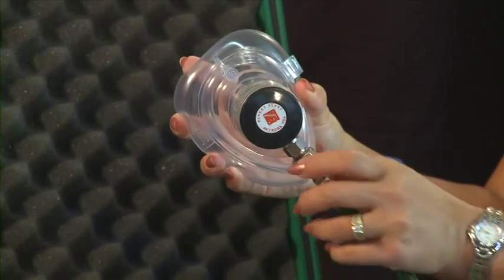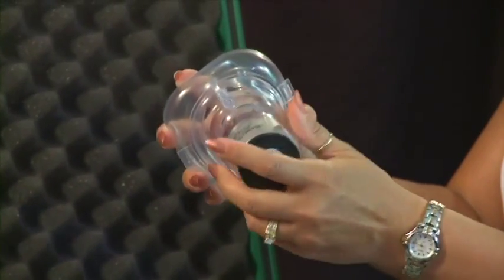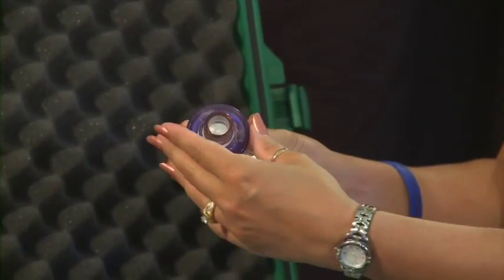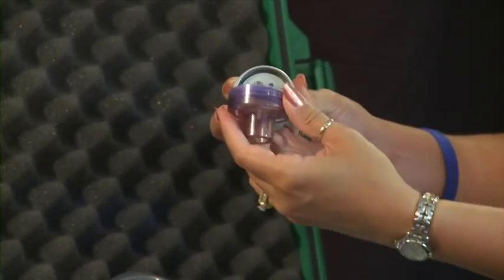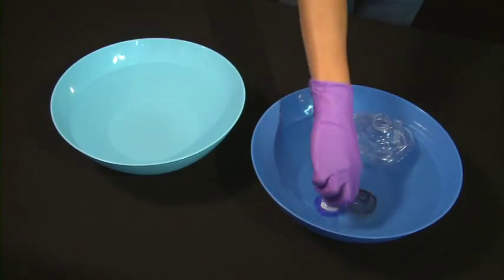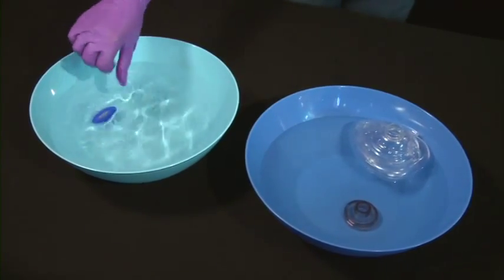Disconnect the demand valve from the green hose. Gently rock the mask back and forth to remove. Unscrew the plastic mask adapter from the demand inhalator valve and remove the exhalation valve assembly. You should clean and disinfect the plastic mask adapter, the exhalation valve assembly, and the mask after each use.